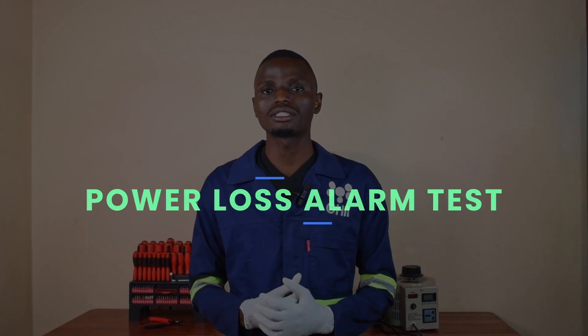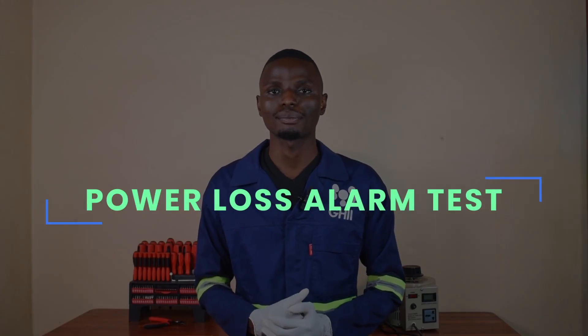First, I will demonstrate the power loss alarm test. The power loss alarm is designed to alert the user that the concentrator is not receiving electrical power. In the event of an abrupt power failure, the alarm should activate to notify the user that the device is no longer functioning.